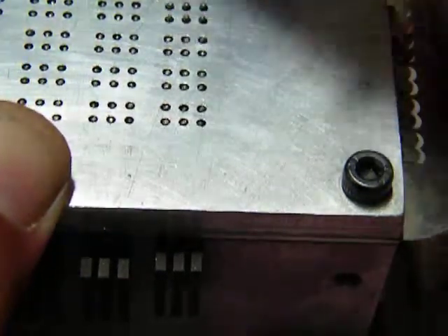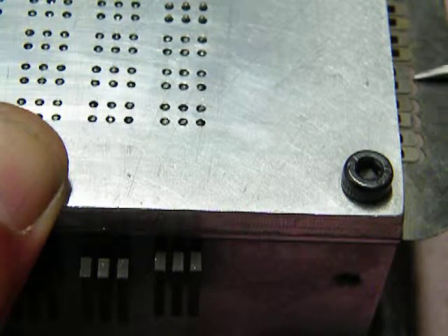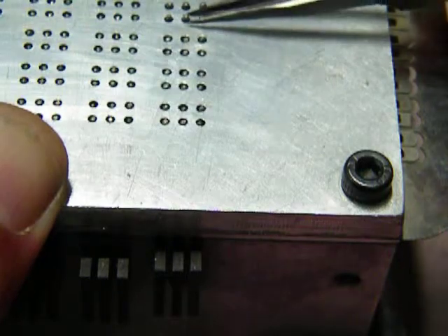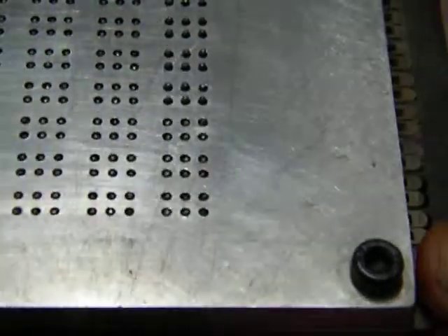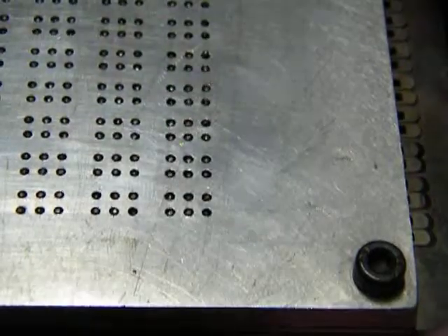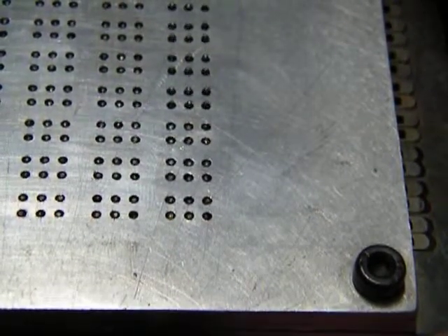But from cell 4 onwards, the first three cells are latched shut. You can see there's a gap here, it indicates that they're latched shut. But this, there's no gap. So that is cell 4 onwards. And cell 4, if you can see now, the pins are up. So you can look at the pins on cell 4. Cell 4 onwards, they just jump up. The whole lot are jumping up.